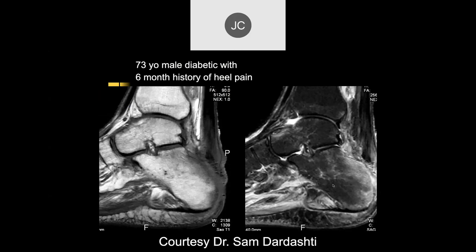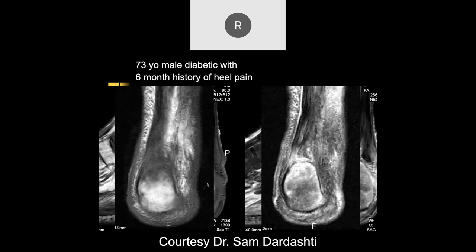We have a 73-year-old male diabetic with a six-month history of heel pain. There's a lot of edema in the posterior calcaneus and it looks like there's a tear of the distal Achilles tendon. There are also some small foci — has there been surgery? No. If there had been surgery, these could be little flecks of metal.